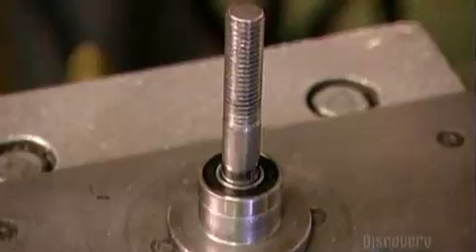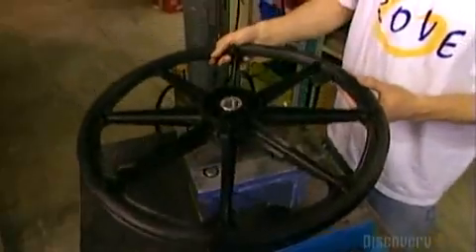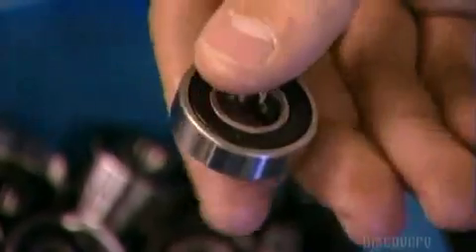Bearings make the wheels roll with ease. Installing them is a delicate operation. Workers use special custom tooling to insert the bearings with extreme precision.